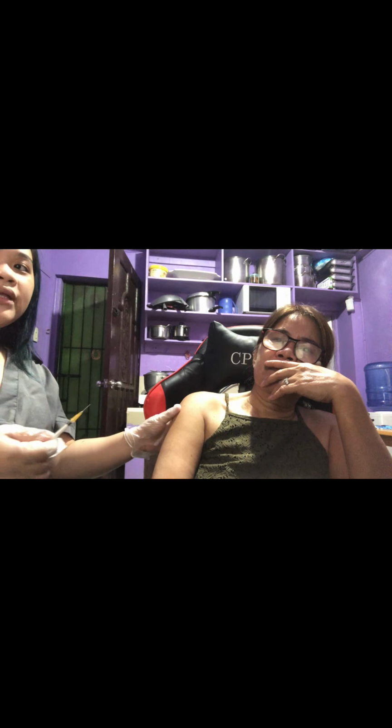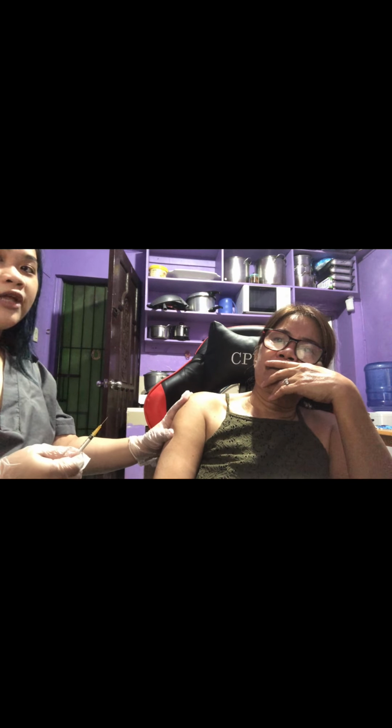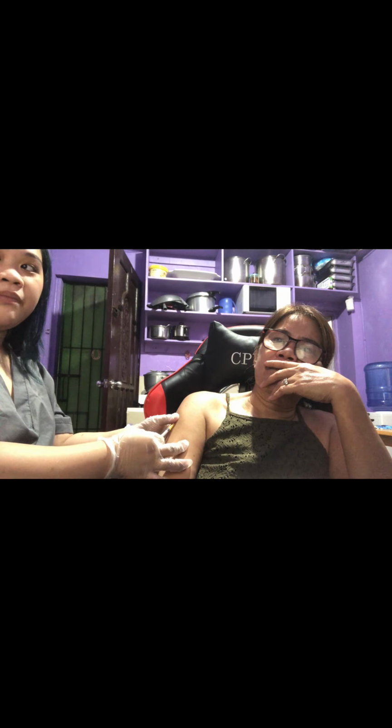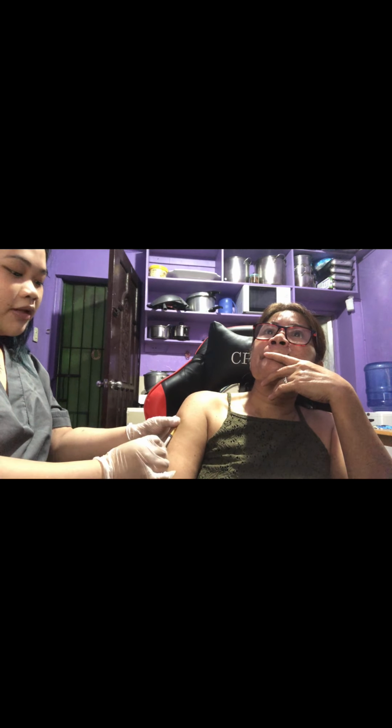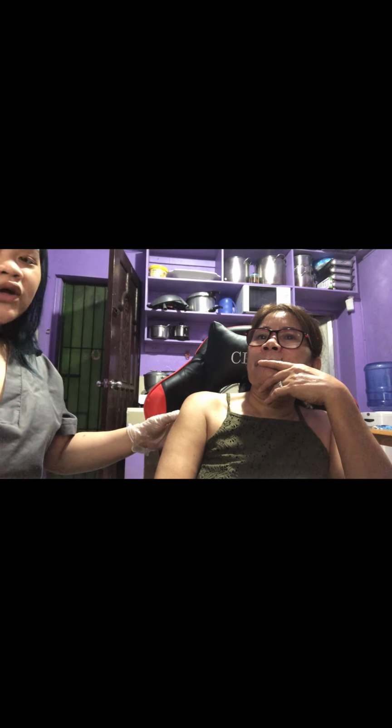Grab the syringe with your dominant hand and remove the needle cap. Using your non-dominant hand, slightly pinch or spread the site of injection depending on the size of the patient. Introduce the needle at a 45-degree angle for a lean patient and 90-degree angle for a patient with subcutaneous tissue around 2 inches thick. But for now, we will use the 45-degree angle. Inject the medication. Remove the needle quickly with the same angle you introduced it. Apply pressure using a cotton ball.